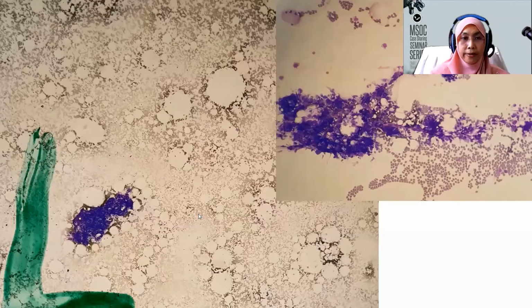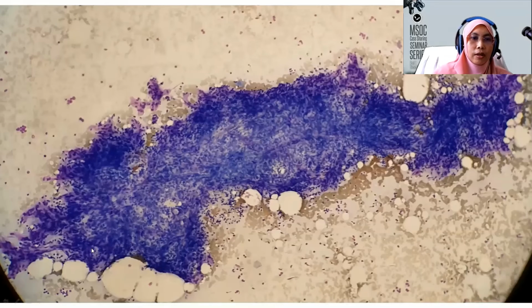Okay, this is the smears. It is more like low to moderate, but more towards the lowish side. There are clusters of cells here, but it doesn't look like a typical ductal or fibroadenoma-like presentation. On higher magnification, you can see there are prominent capillaries here and there with intermingled small cells surrounding the vessels.